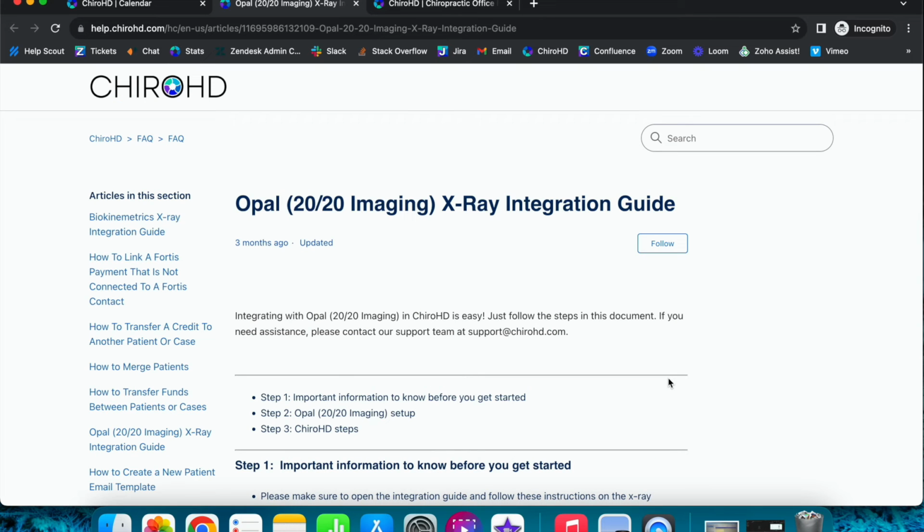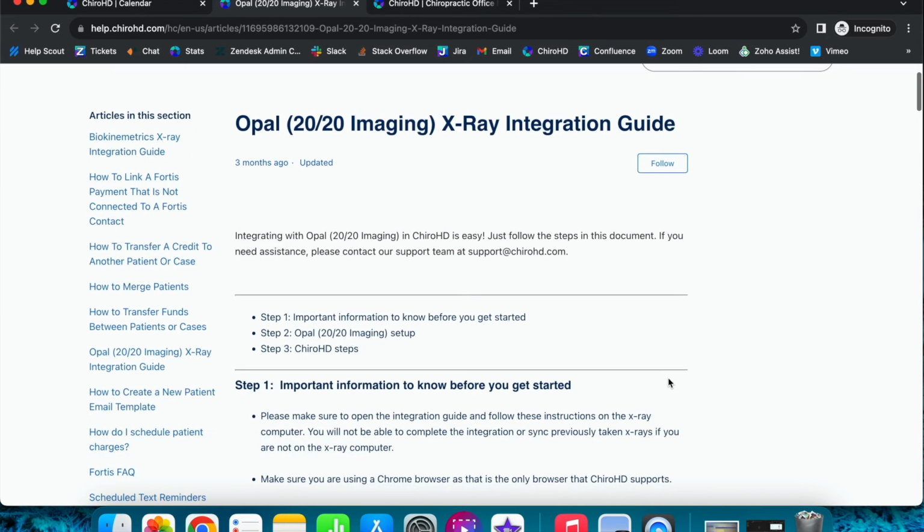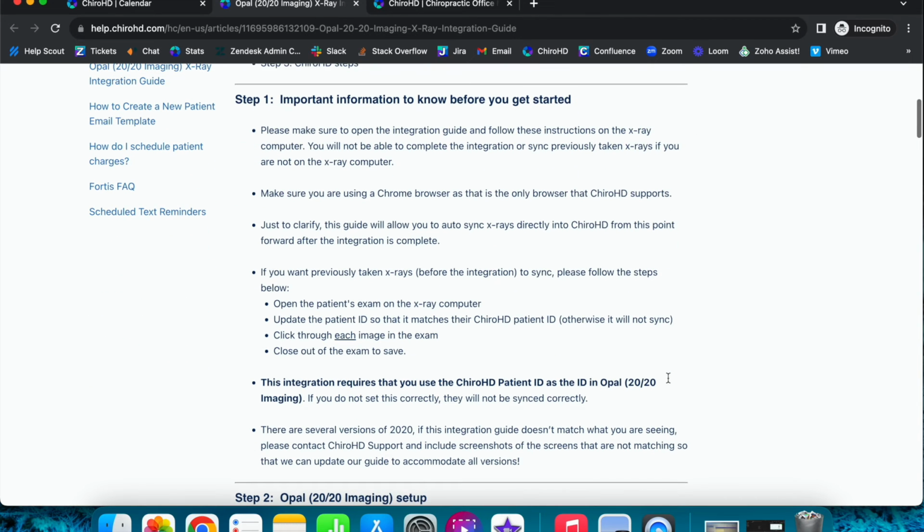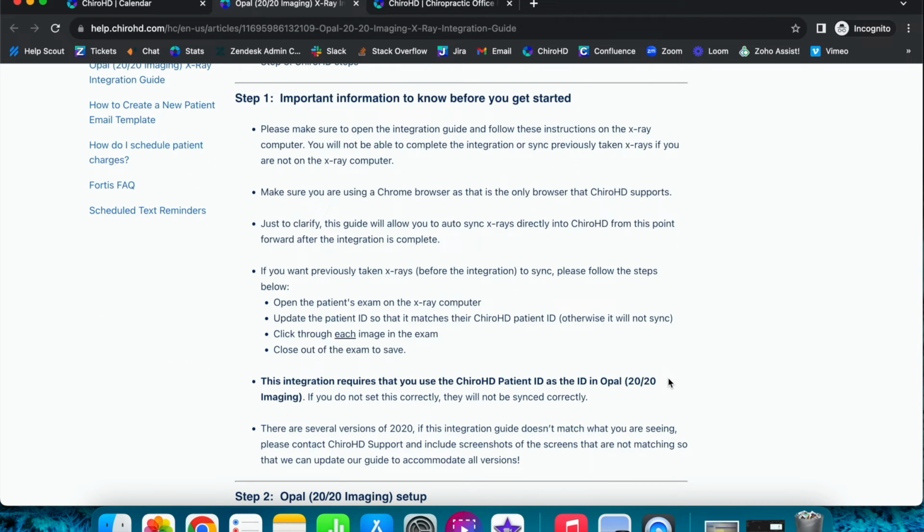I am not going to go through each step of the integration guide in this video, as this guide is pretty detailed, but I just want to go over what the basic integration is and point you to this guide. If you run into any issues after setting up the integration, the first thing I would encourage is to restart your computer. If you're still running into issues after that, please reach out to support and we will connect you with our agent who specializes in the X-ray integration. So there's no need to get worried. We have someone available to help. But if you follow the steps as they are set out, you should be able to set the integration up on your own.